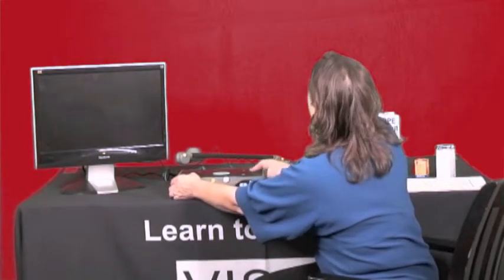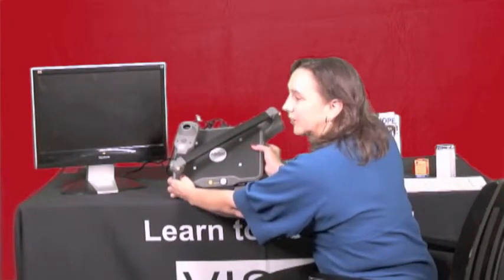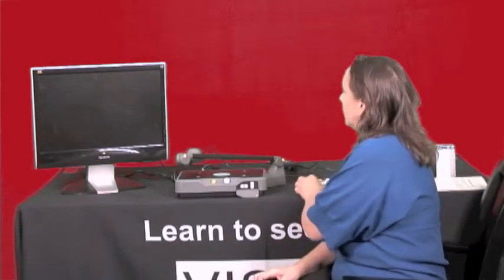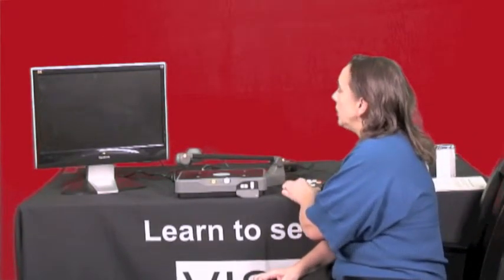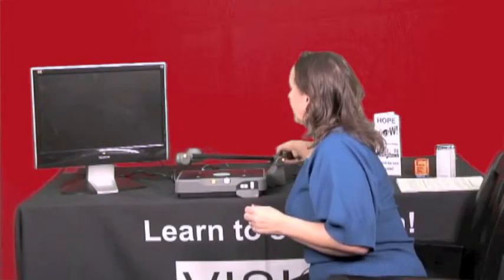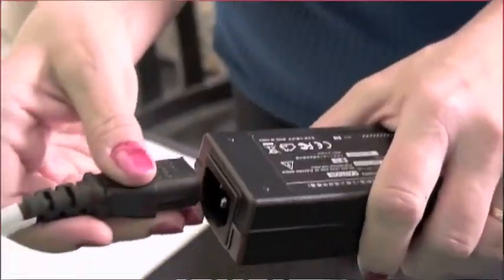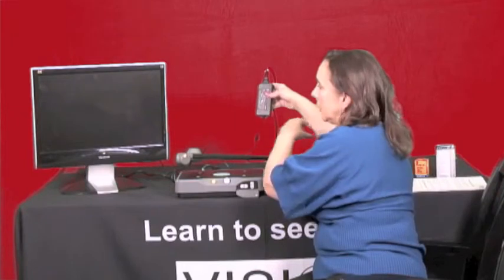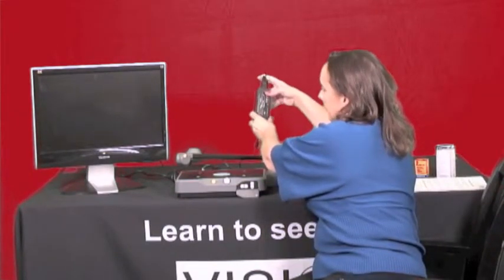So when you first get it, you're going to get it in a nice white box. You'll pull it out of the box and it's going to be very lightweight, about 6 pounds. You're going to lay it on a flat surface. Also coming with it is your remote that you'll plug in, and a power cord that comes in two pieces.